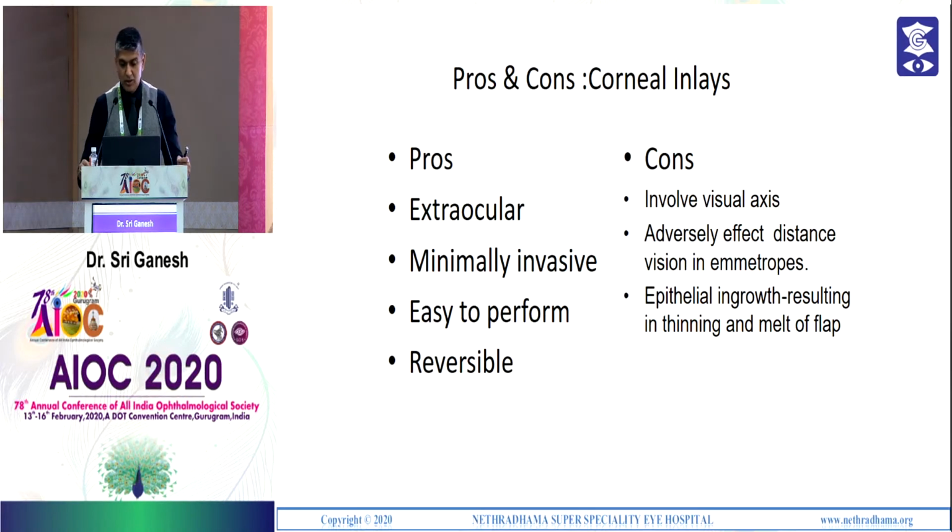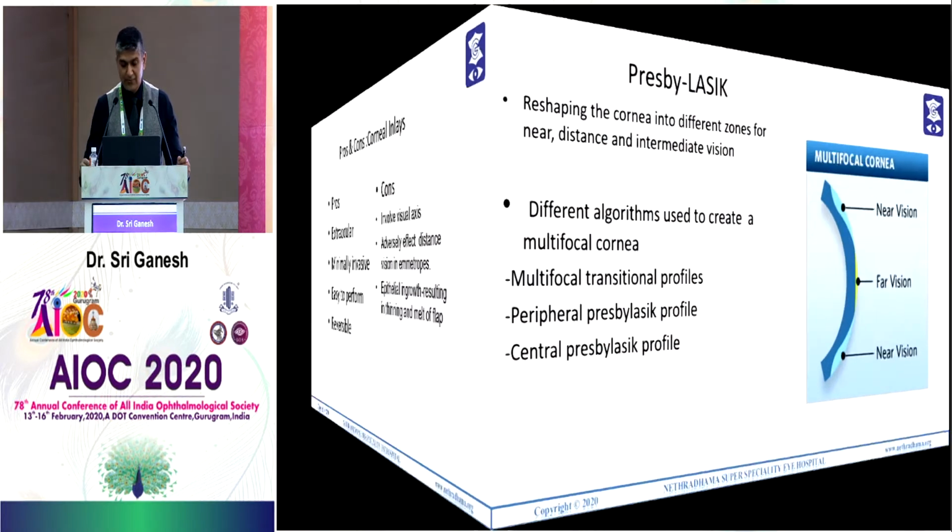The pros and cons of corneal inlay: the pros are it is an extraocular procedure, minimally invasive, easy to perform, and reversible. Cons are it involves the visual axis, adversely affects distance vision in emmetropes, and there can be epithelial ingrowth resulting in thinning and melting of the flap.